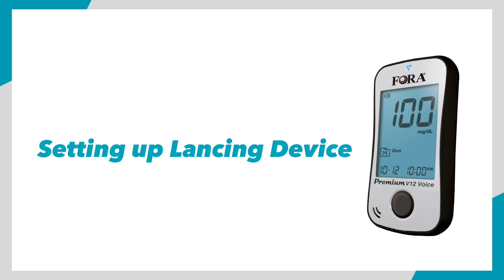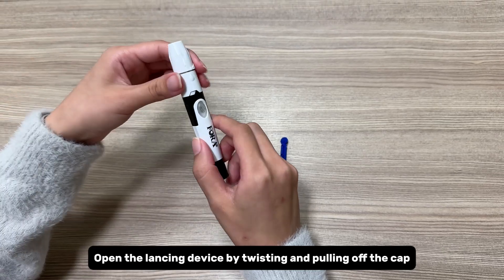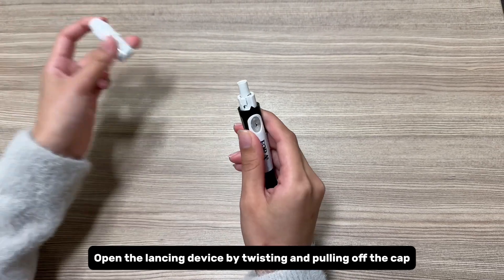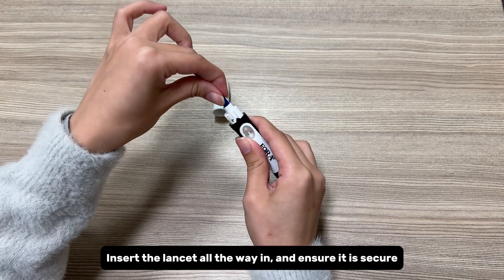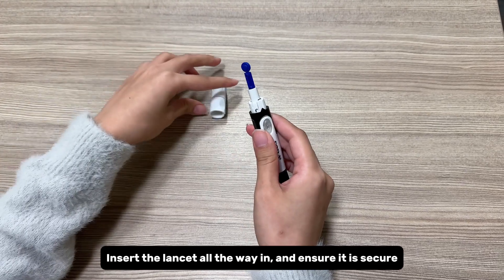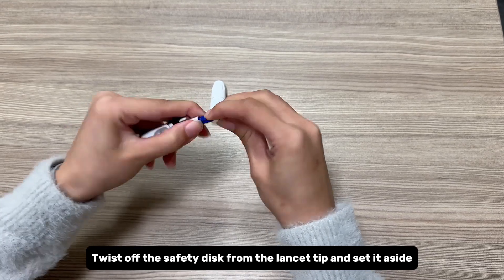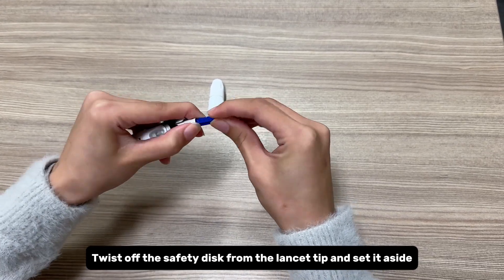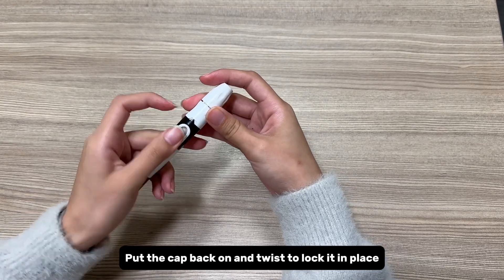Setting up the lancing device. Open the lancing device by twisting and pulling off the cap. Insert the lancet all the way in and ensure it is secure. Twist off the safety disc from the lancet tip and set it aside. Put the cap back on and twist to lock it in place.